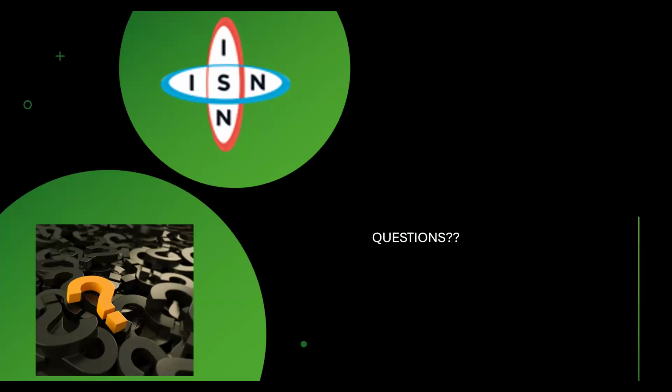No, there is no format. Like what we mean by documentation is just like a printout of all this, your calibration, your validation, just to keep it for accreditation.